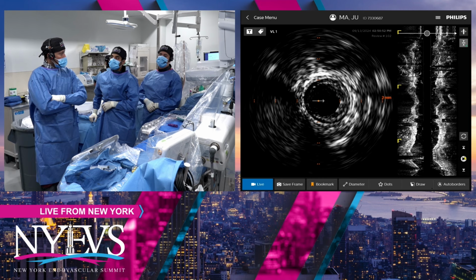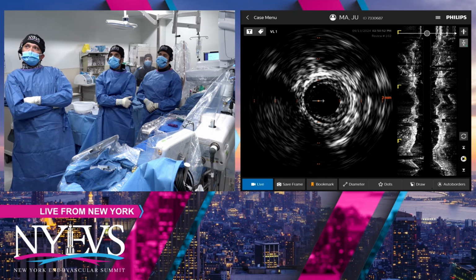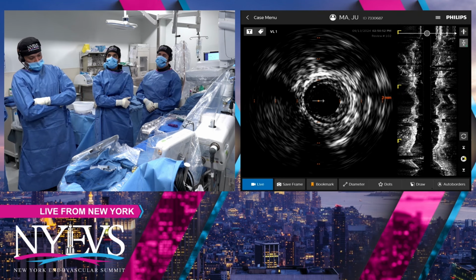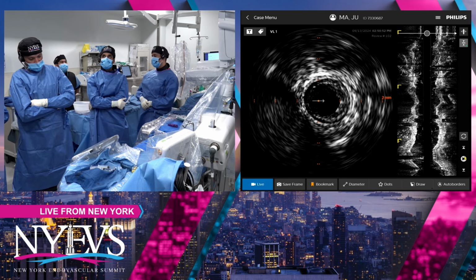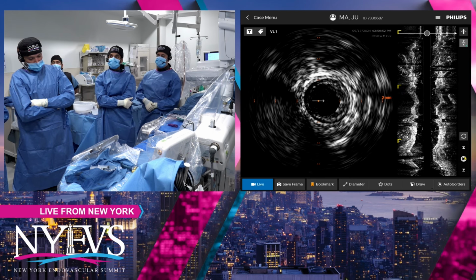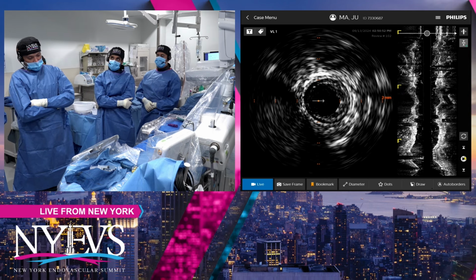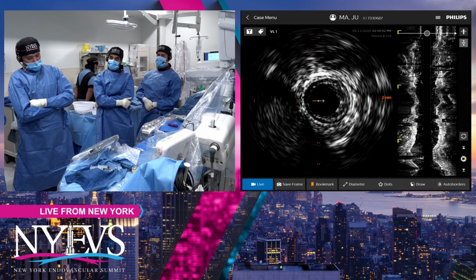Basically, the aspiration capacity of the Rotarex is so high. You have seen probably during the lunch session, if you have not enough inflow into the artery around the catheter, the vessel, including the stent, does collapse. So if you can result in vessel collapse, there can't be any distal embolization, because if you have material which is potentially embolic, it will be removed by the device itself. So it's really a very safe device regarding distal embolization.